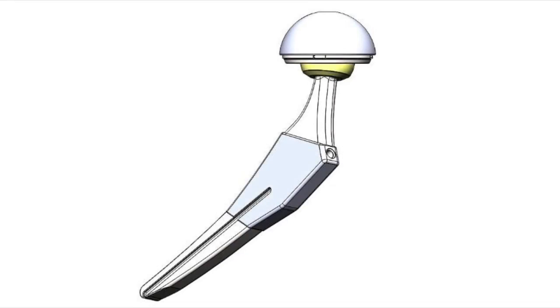In this part, I'll be explaining my designs which are created on SolidWorks, and how I started and how I developed throughout. So in my first design, I designed an implant with the acetabular component, plastic liner, the femoral head, and the femoral stem. However, some of these components are not going to be used in my test, which means that I have to redesign and make it to the correct one.